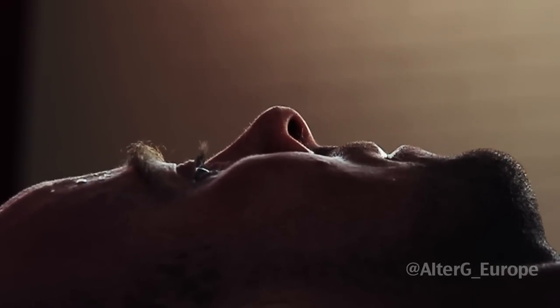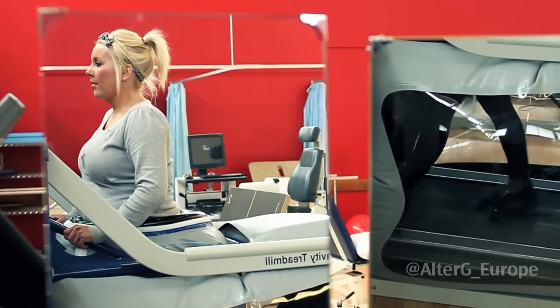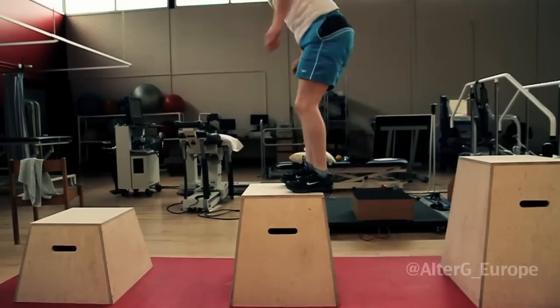The psychological benefit has been remarkable. Some of these patients haven't weight-borne in years, and to within a period of eight to ten weeks start to weight-bear on the AlterG and then transfer that carry-over onto dry land — that's been quite a phenomenal change.